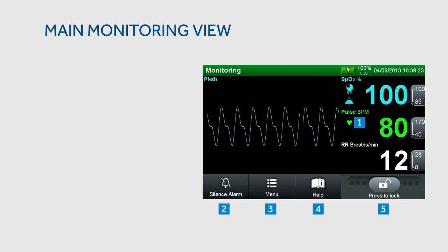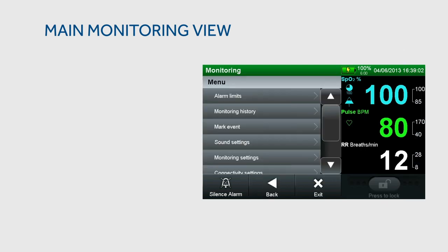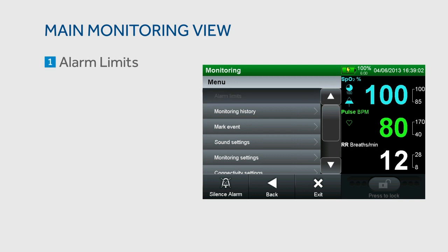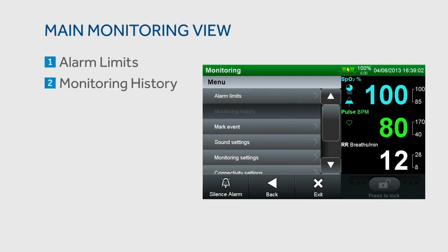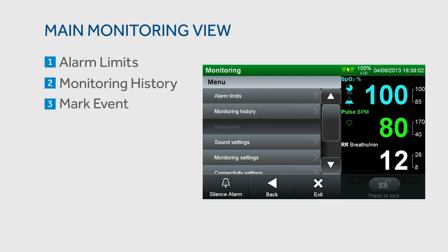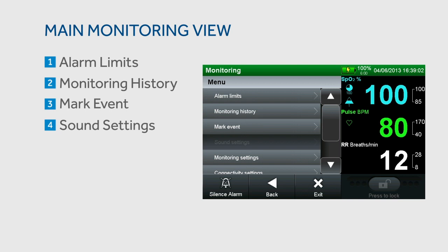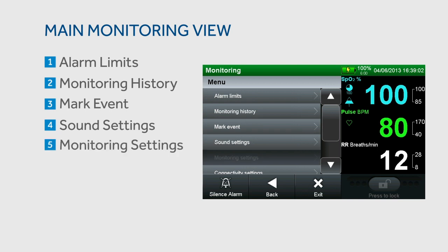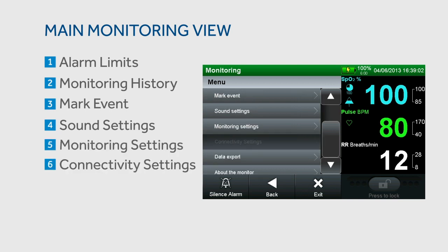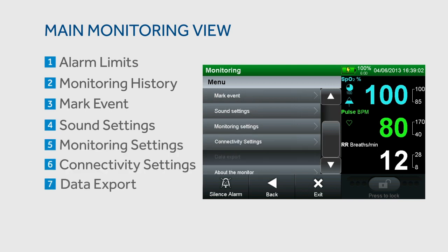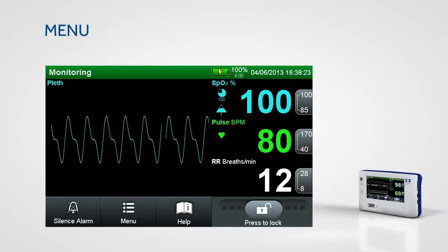Under the menu, you have the ability to modify several settings including alarm limits, monitoring history, event marking, sound settings, monitoring settings, connectivity settings, and data export.